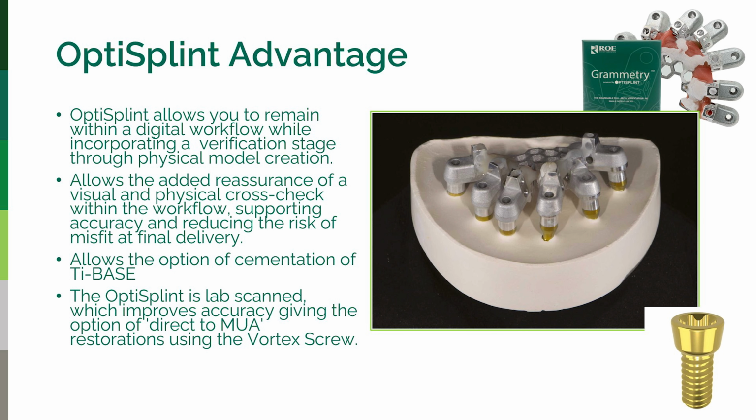Just to look at some of the advantages of the Optisplint workflow. The Optisplint allows you to remain in the digital world, but it does give this comfort of having an analog verification step. Many dentists do like that, especially if they're transitioning into the digital world and don't yet trust a fully model-free workflow, something that we very much understand. That added reassurance of a visual and physical cross-check really makes many dentists feel more comfortable.